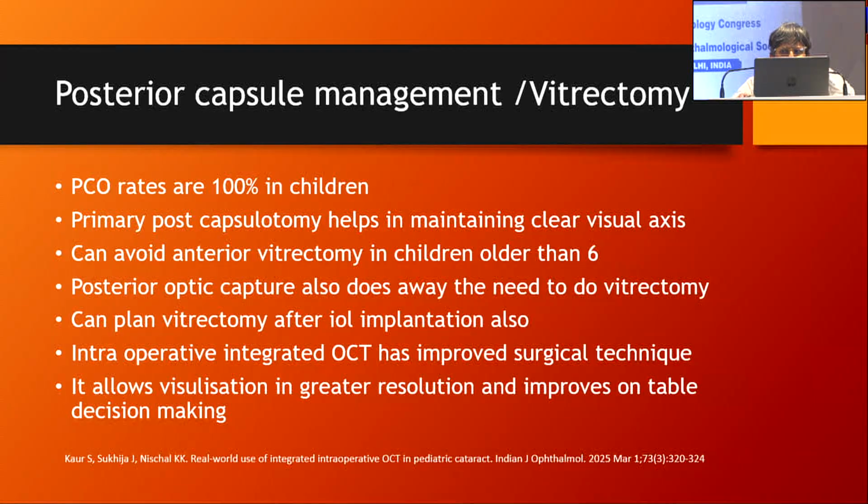So posterior capsule management, again very important, because a beautifully done surgery can be undone by PCO within a matter of few weeks or few months. So whether every child needs anterior vitrectomy, probably not. Children who are older than 6 or cooperative enough to allow you to check pressures in the OPD, probably you can leave anterior vitrectomy and just do PPC in them.